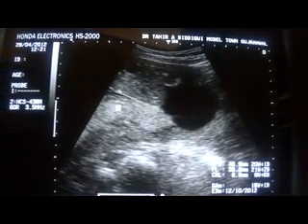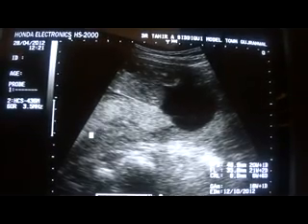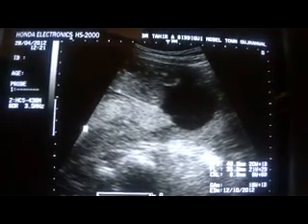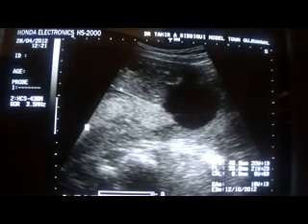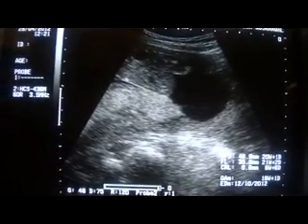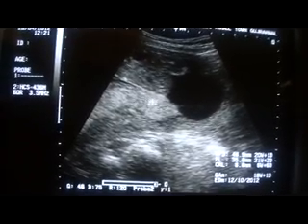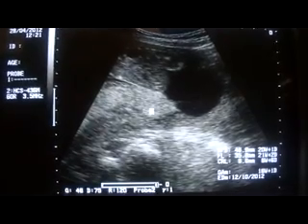This is the cervix — this area. This is the cervix and this is the amniotic fluid, this blank area. This is the anterior abdominal wall. So the placenta is low lying and it is almost 2.5 centimeters away from the internal os. This is the cervix.